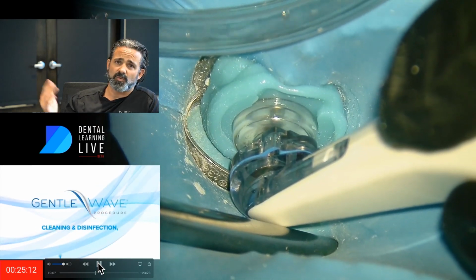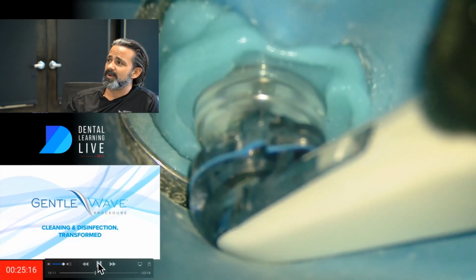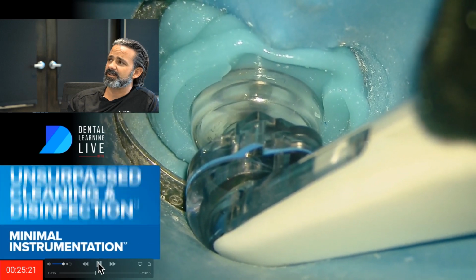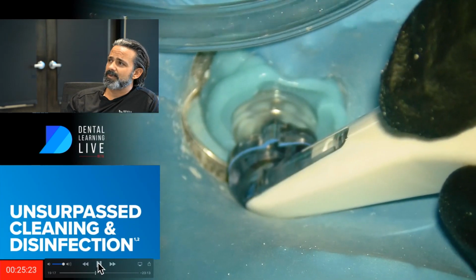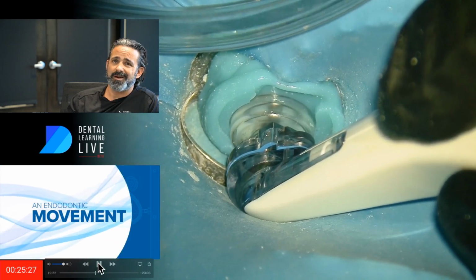And so that's what I'm doing and why I'm doing that. It's like I'm using chopsticks there with my mirror. And I really like to look at the exhaust here. Let's see if I can get it in focus. You can see the exhaust tube. I'm trying to show what's coming out of the tube.